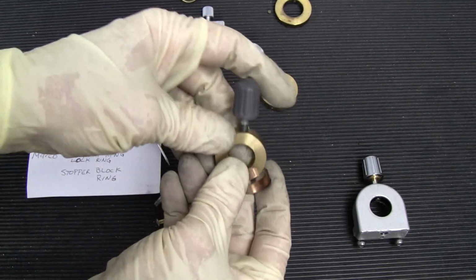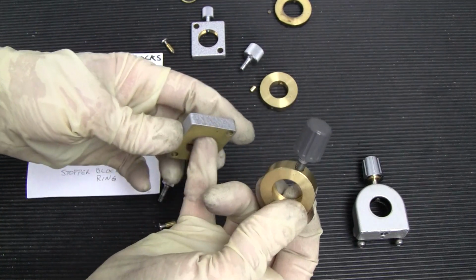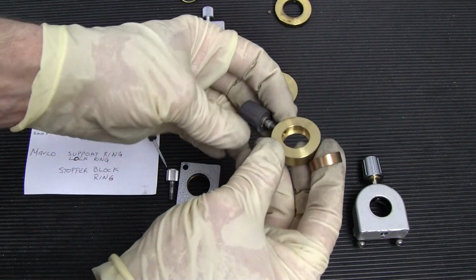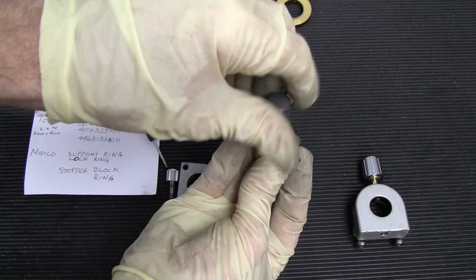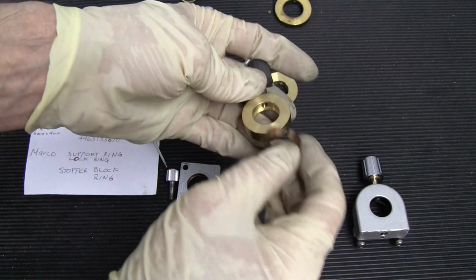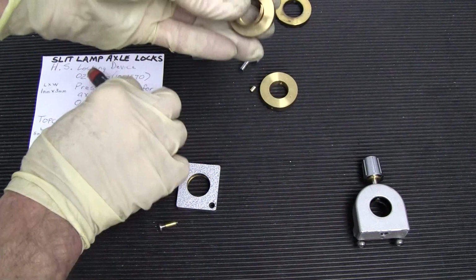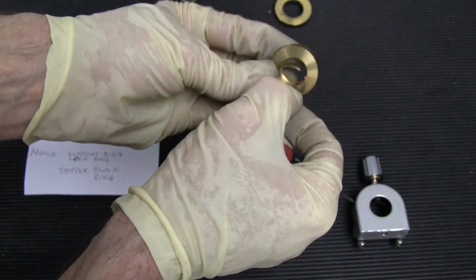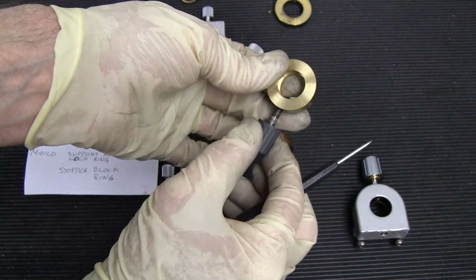And here's an example of another kind on the inside. They use the same principle of having a ring inside, but now this is on the inside. It also has a ring. So if you took this off and you could see it, then you would know that this ring, the opening, is right where the screw is. So similarly, you would take it off and move it around so that now it's away from there, because they start turning as you're moving the axle.